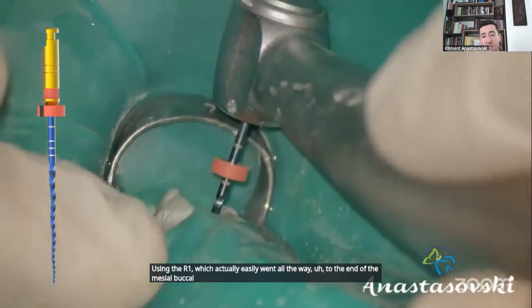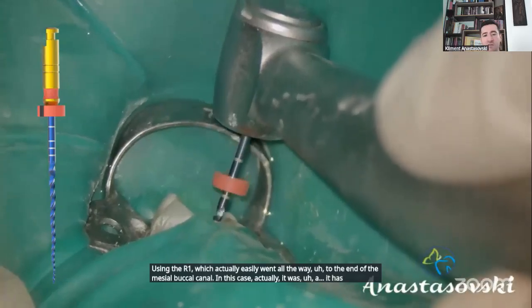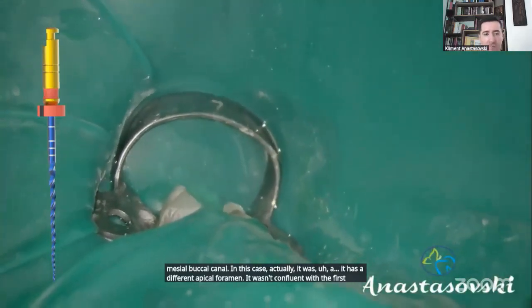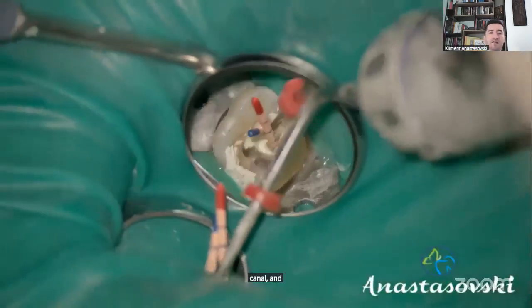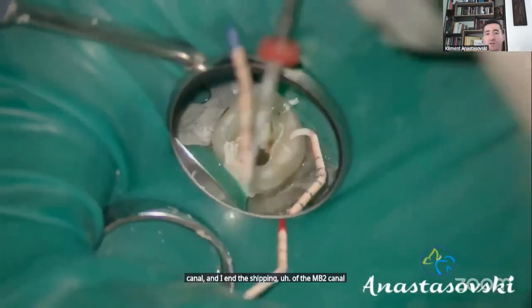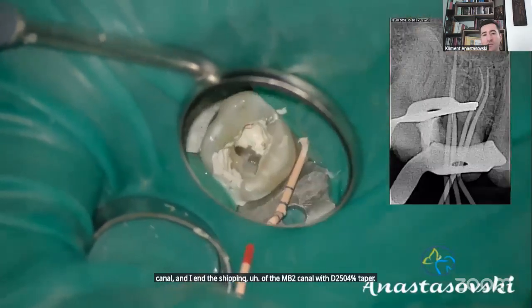In this case, it had a different apical foramen. It wasn't confluent with the first mesiobuccal canal, and I ended the shaping of the MB2 canal with the 25.04% taper, or the R2.